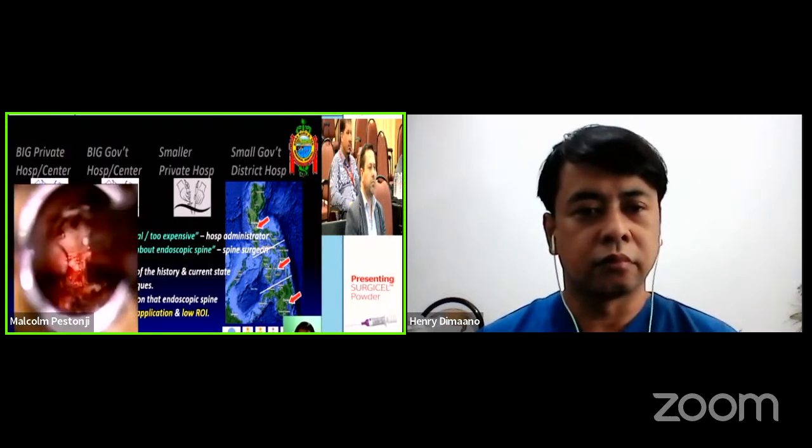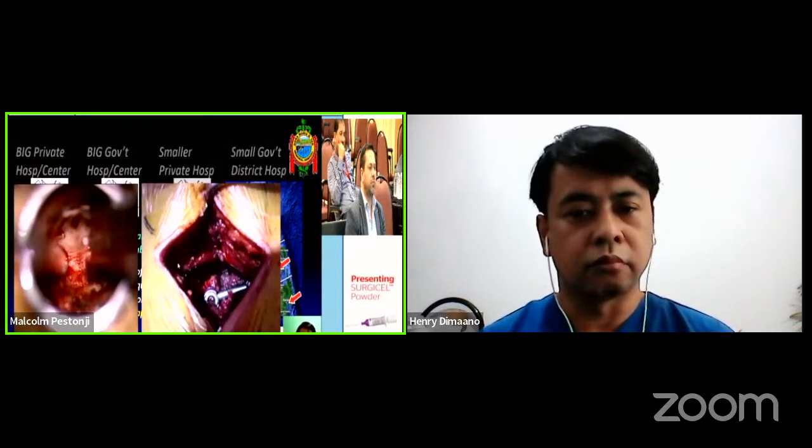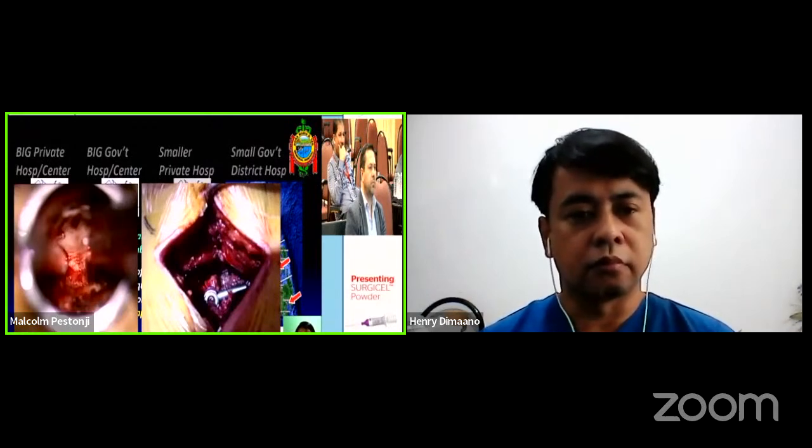This is a view through a tubular retractor system using a microscope. It's an open surgery, you're viewing through air. This is a mini open approach, it's actually my surgery, this is the one on the right. I've done a single level fusion, a TLIF here using this incision. The sizes, of course, are different. This is smaller than this, but the approach is basically the same. The feel is the same. The appearance of the anatomic structures is practically the same.